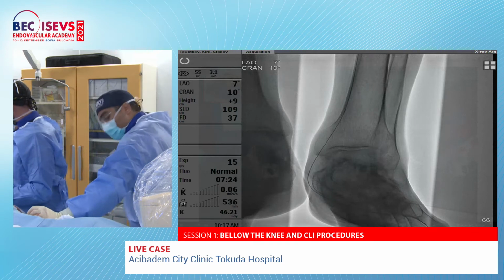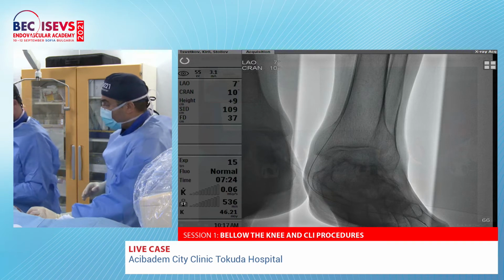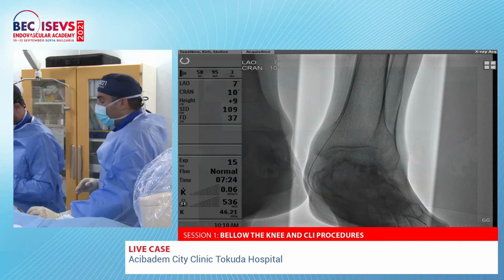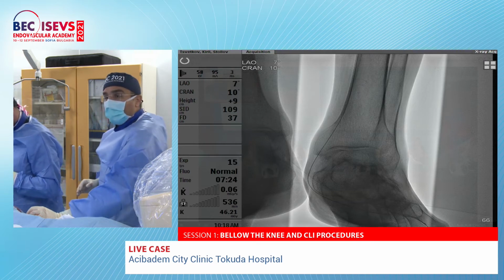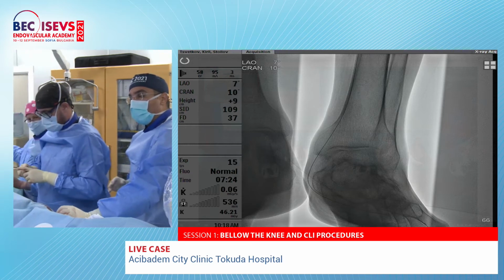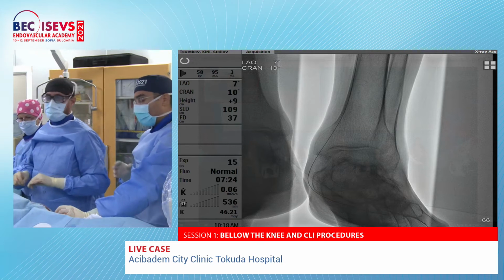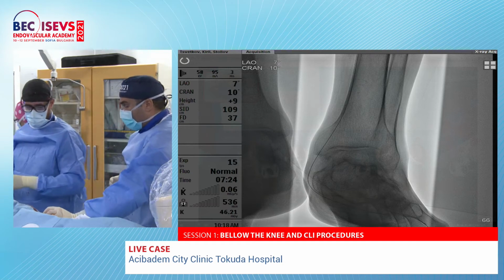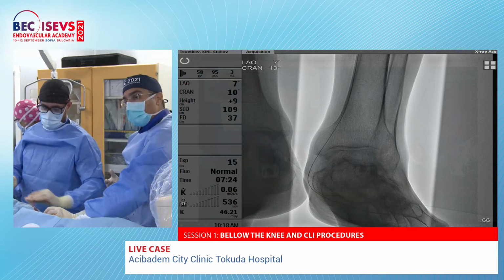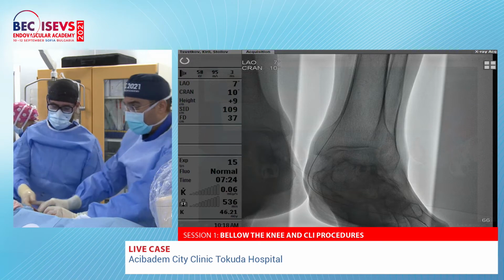Do you have any question until we have the support catheter? Are you planning to change the wire? With which one? At the moment, not yet. We can do this to change the wire, but I'm also starting using more frequent 018 wires for below the knee, especially if we have patients like the one here with relatively big vessels. We're going to use a 3 millimeter balloon, and we will see.